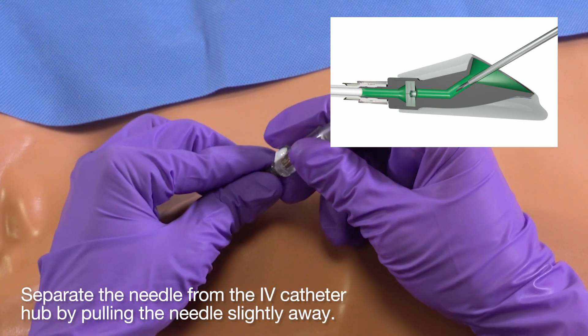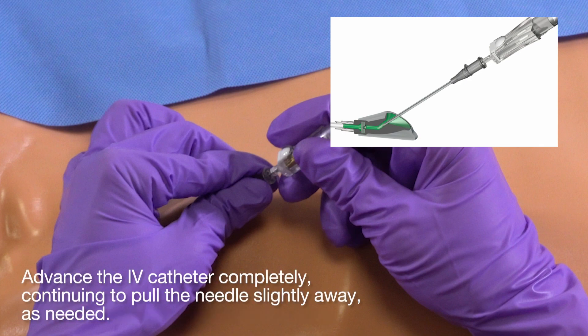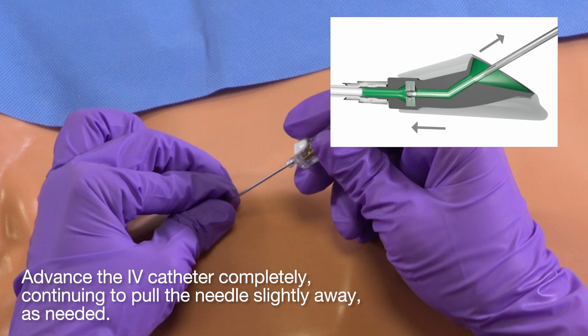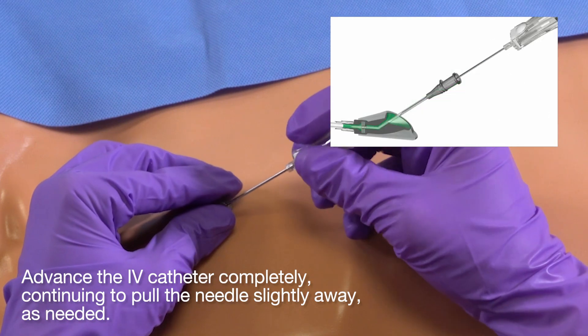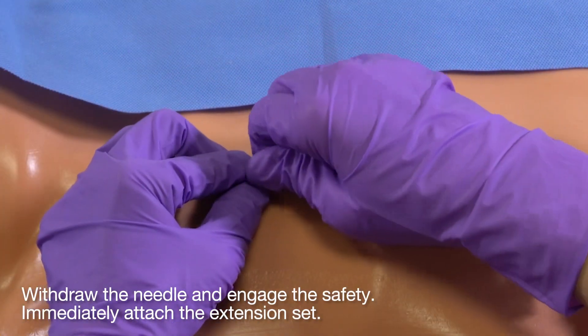Separate the needle from the IV catheter hub by pulling the needle slightly away. Advance the IV catheter completely, continuing to pull the needle slightly away as needed. Withdraw the needle and engage the safety. Immediately attach the extension set.